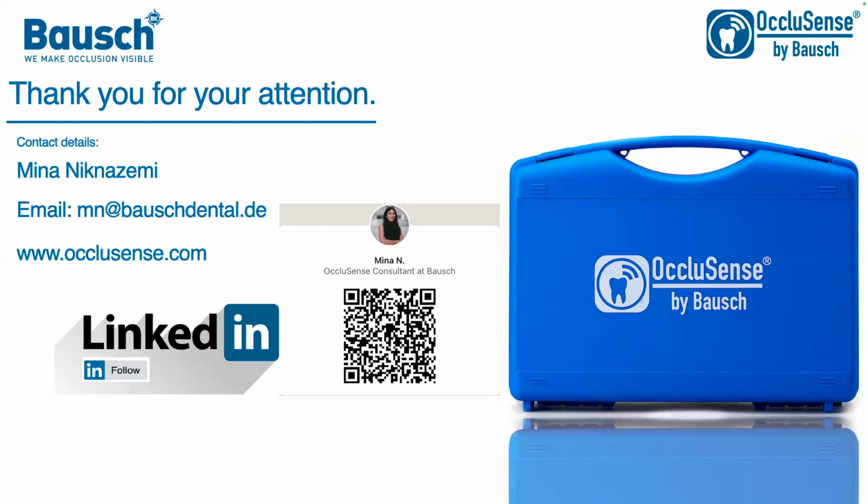Since this has both a pressure indicator as well as a pressure sensor, I think the clinical interpretation becomes easier, because the transfer is happening immediately as the pressure is being sensed. I think that helps.